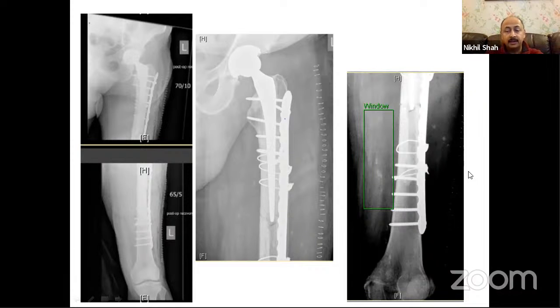well fixed. And my colleague mentioned that the proximal fragment also, if you try and take out all of that cement out from nearly 170 millimeters of a long cemented stem, it is probably going to cause a lot of destruction. And Sanchit mentioned this point as well. When you have so much cement to take out, and if the fracture can be fixed with sound principles of internal fixation, then fixation can work as a very good option.